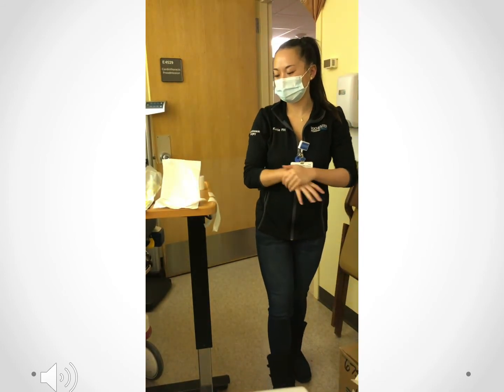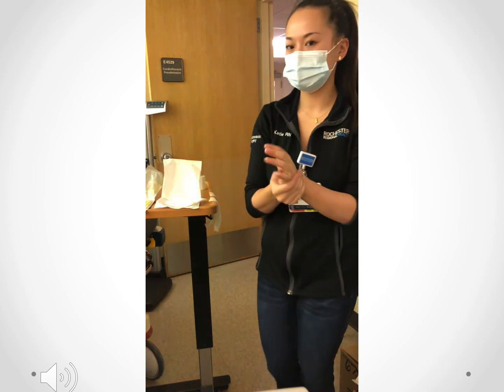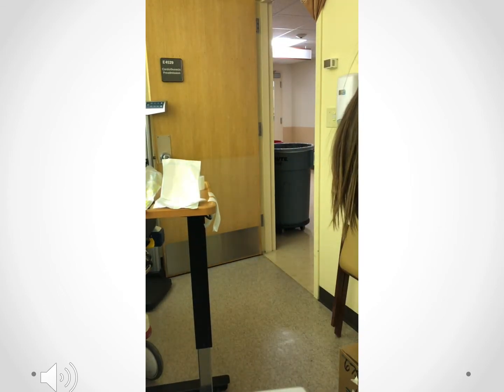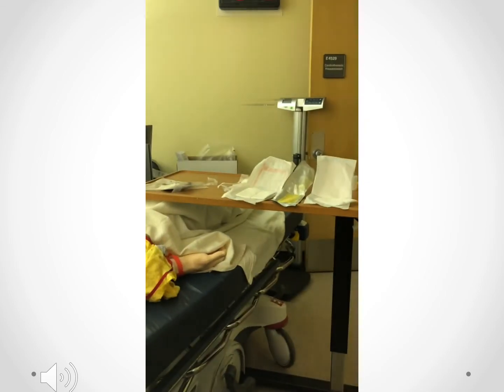Now Katie will place her gloves. She will actually place 2 pairs of gloves on, as the xeroform which we use during the dressing change is very messy, and therefore you need to take off a layer of gloves.